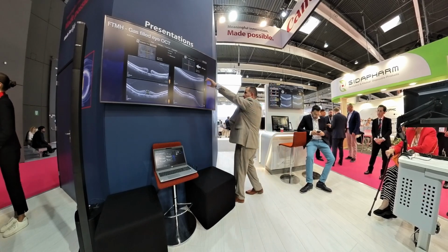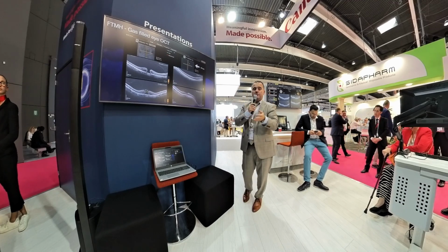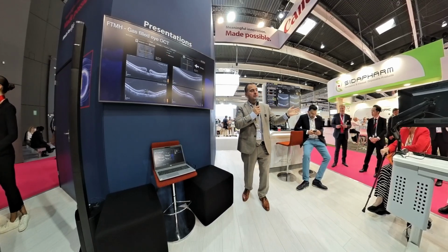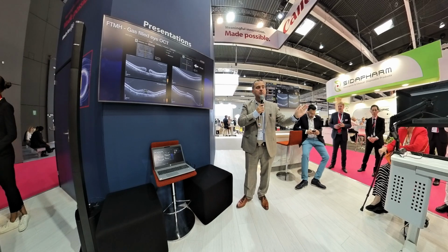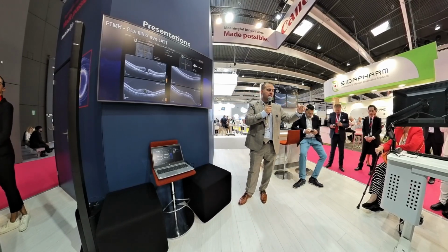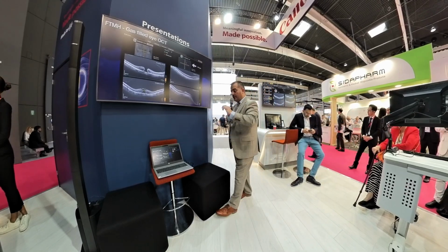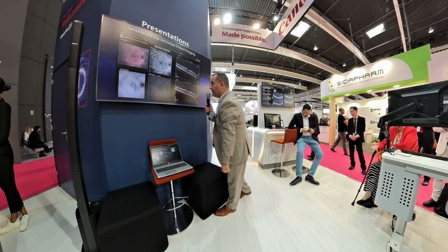So here it's obviously a gas-filled eye, and on the first day we can show the patient your surgery is successful because you have a closed macular hole. Otherwise, he needs to wait at least 10 days until the gas resolves for the result. So it's another unique feature of this OCT.